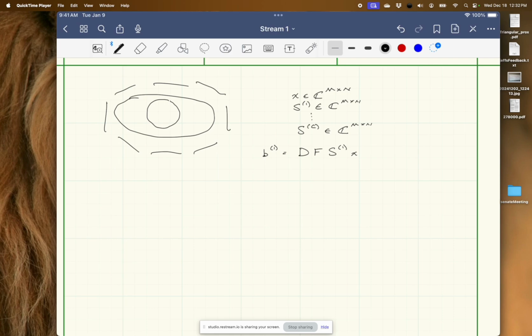And it isolates which data samples were collected. And so, of course, we have these for all coils, capital C coils.